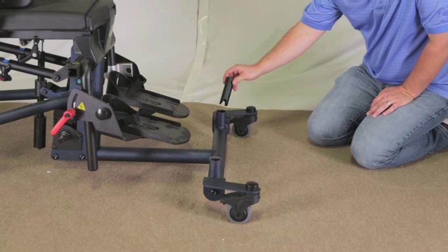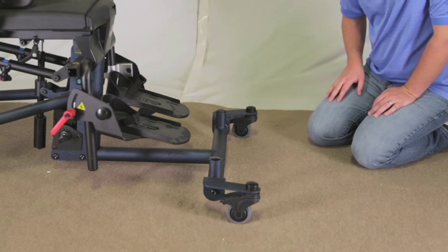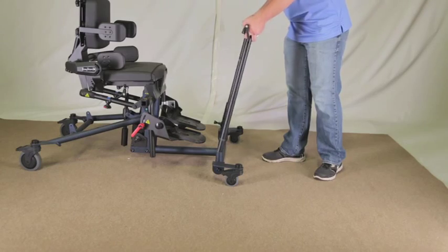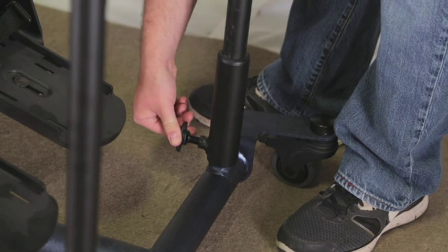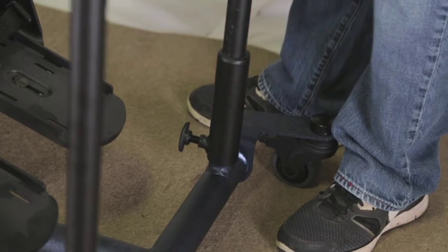If the swing-away front was ordered, make sure the tube insert is placed in the front of the frame as shown. Place the H-frame onto the unit as shown, with the collar part of the H-frame on the tube insert side. Place the collar onto the frame until the plunger locks into place. The plunger handle needs to be pulled out to lock into place — move the collar to lock into place.